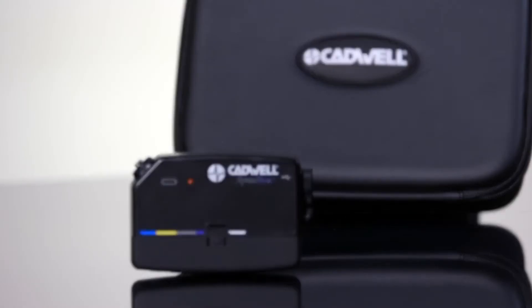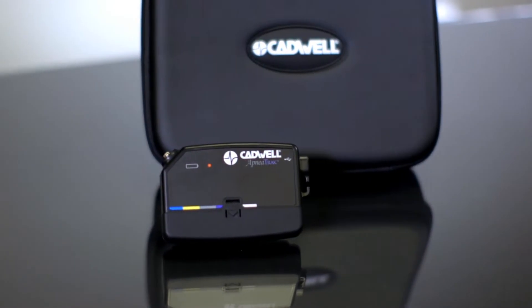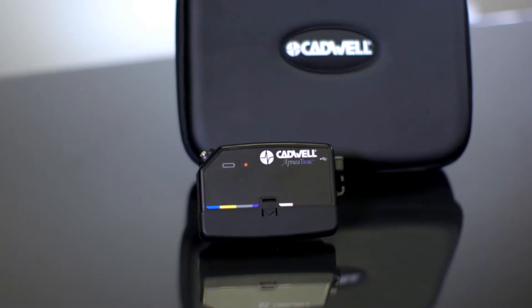Your healthcare provider has determined that you will participate in a home sleep apnea test. The Cadwell apnea track will collect data on your breathing and snoring while you sleep.